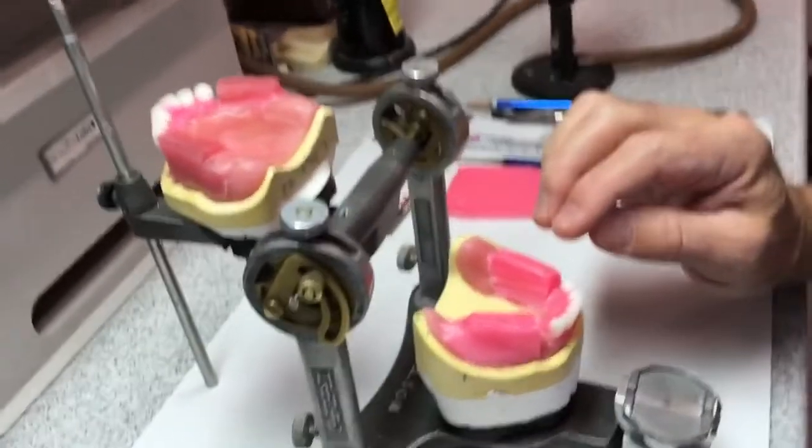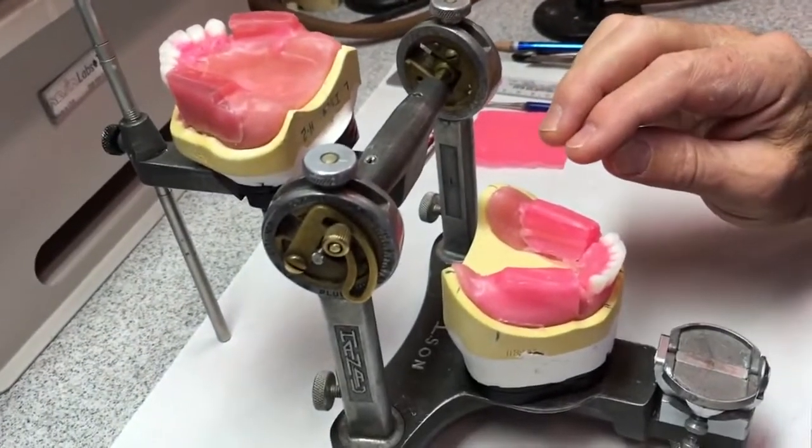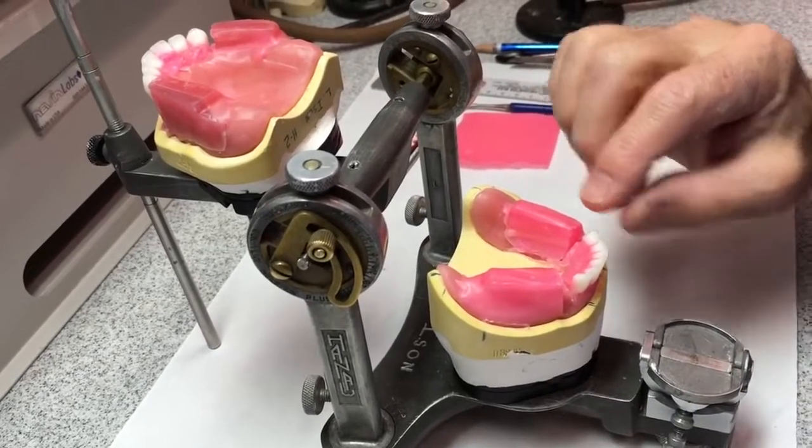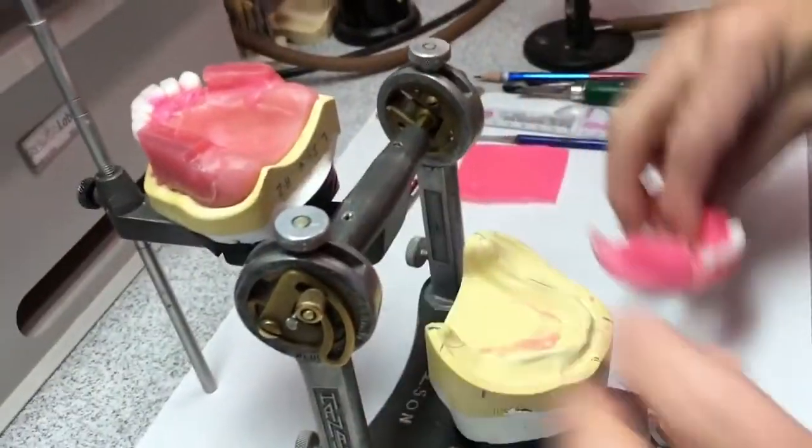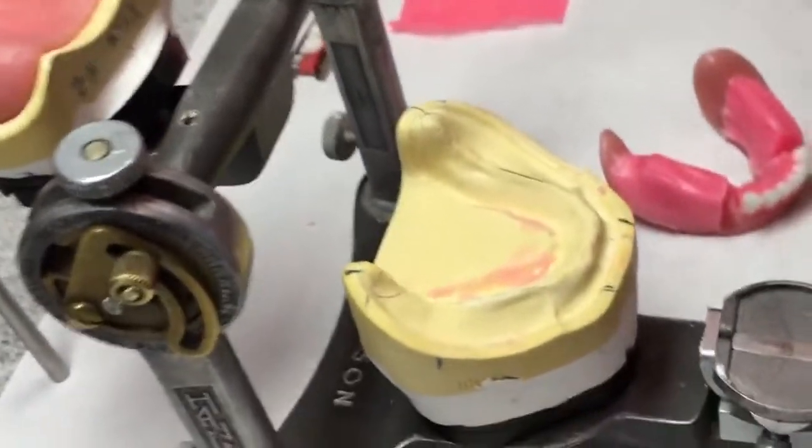I'll try to do at least one side in five minutes, so I'm going to move a little quick. The first thing you do before you ever set posteriors is you mark where the ridge is on the land area of the cast.